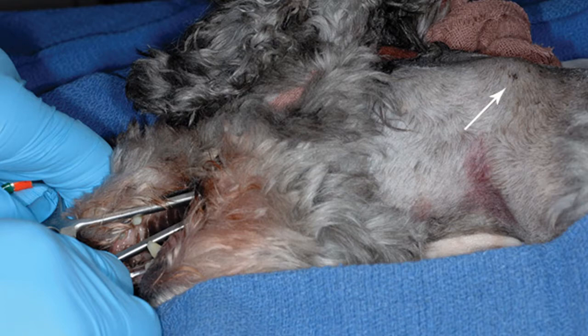Once you are ready, insert your long forceps into the oral cavity and extend it into the cervical esophagus with the curved tips facing outward and dorsal to the jugular vein. Just put enough pressure on the forceps to press its tip against the skin. Make sure the forceps are long and thin enough to get through the boundary of the oropharynx and the esophagus, which is guarded by the hyoid apparatus.